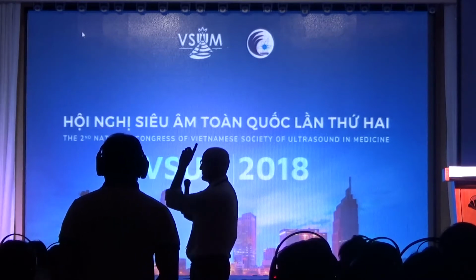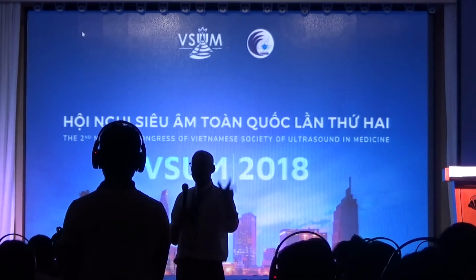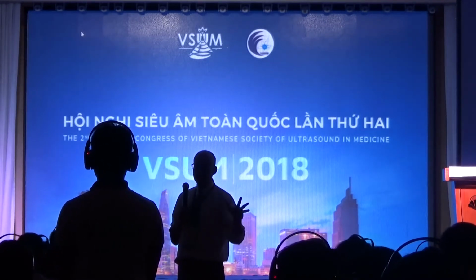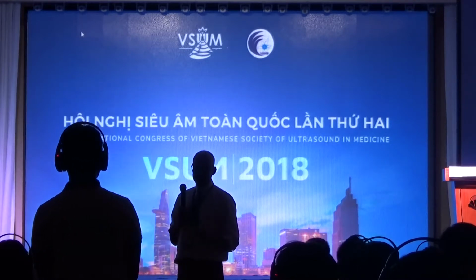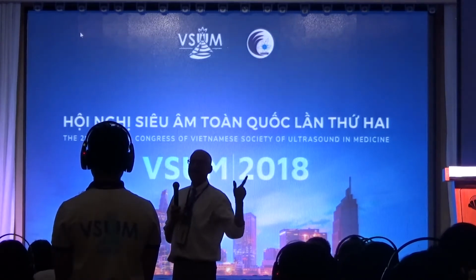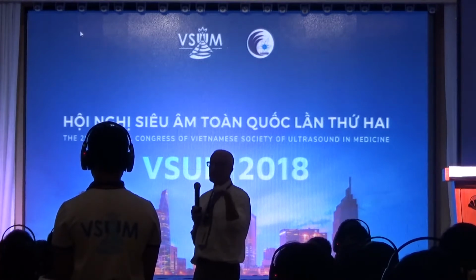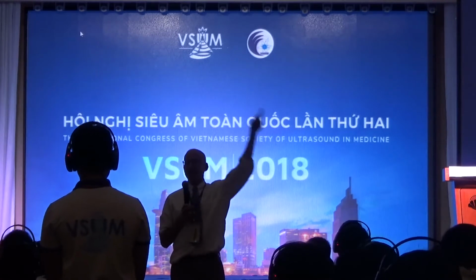Then in my report will be the machine, the transducer, the frequency of the transducer used, the program, the depth of measurement below the liver capsule, how many valid measurements, the median of the 10 measurements using point shear wave elastography, and the interquartile range.